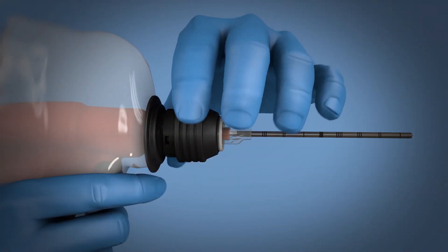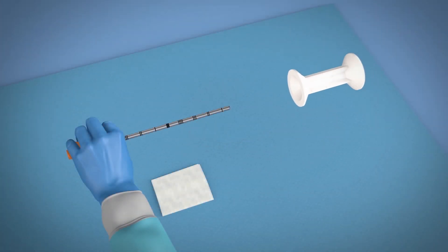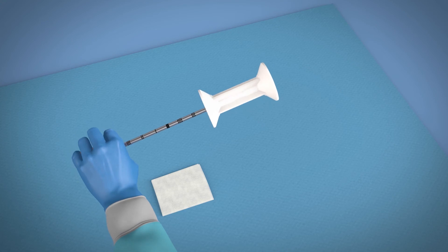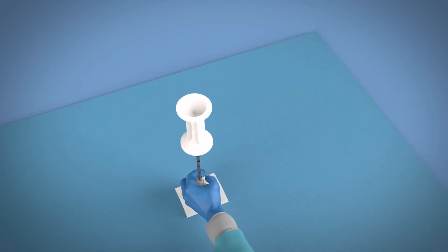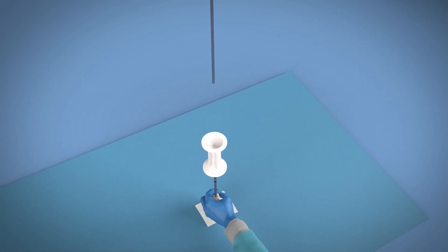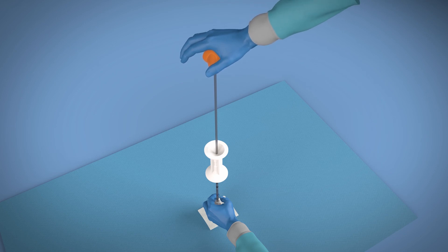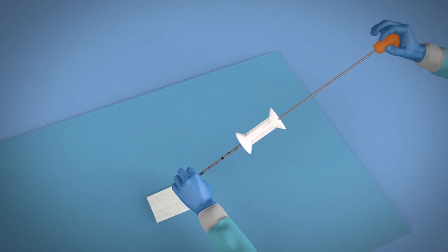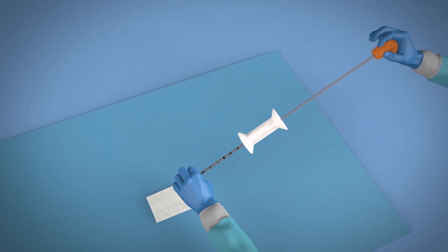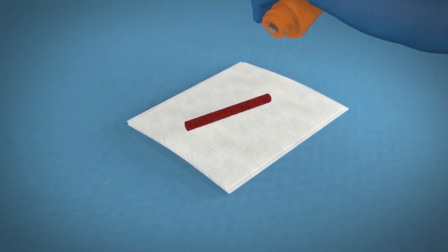Retract the black collar and remove the needle. Insert the tip of the cannula into the white alignment guide. Turn the cannula and alignment guide upside down with the needle hub placed on a flat, secure surface. Insert the ejector rod into the other end of the alignment guide and gently tap on the rod end. Ensure the needle hub is not touching any surface to avoid damaging the core sample. Slide the ejector rod down through the cannula, gently pushing the core sample out of the needle hub onto sterile gauze, a specimen container, or slide.